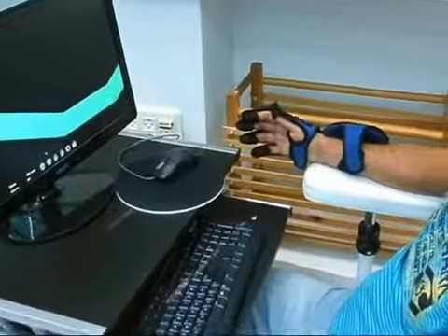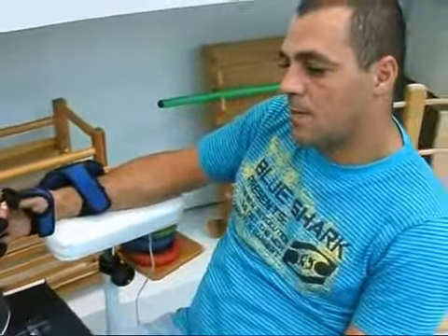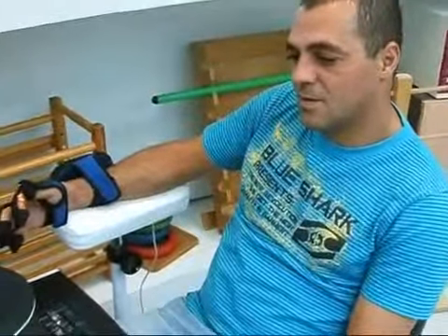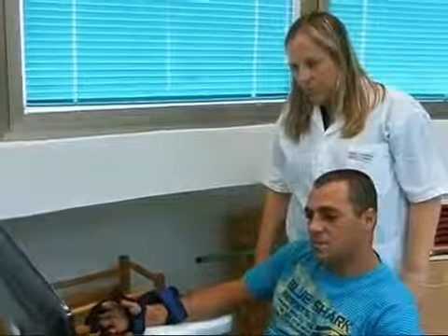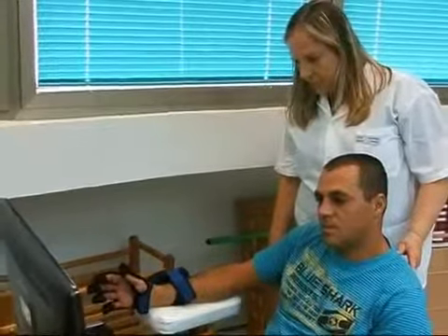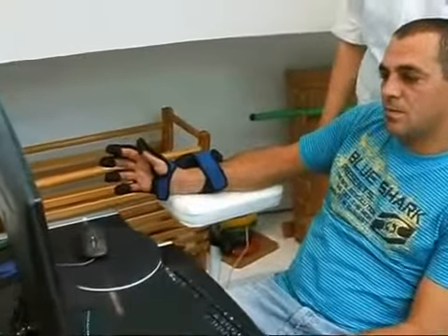Here we see the patient performing intensive active finger exercises according to his movement ability. The patient is a CRPS patient. The system allows the patient to practice repetitive active exercises in the form of motivating and challenging games, customized to the patient's motor, sensory, and cognitive movement ability.